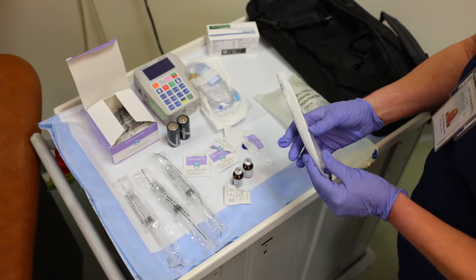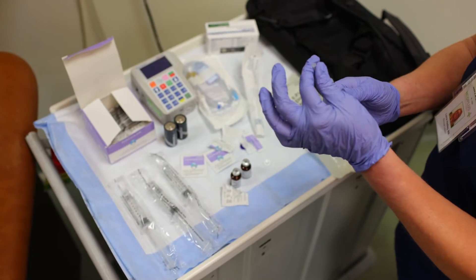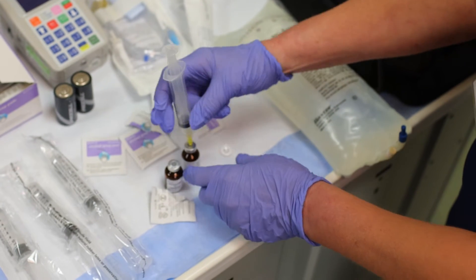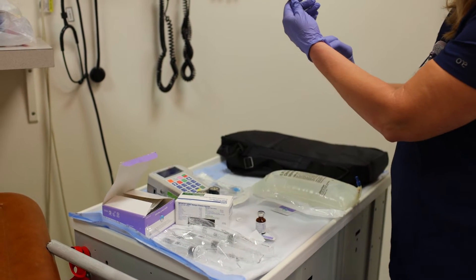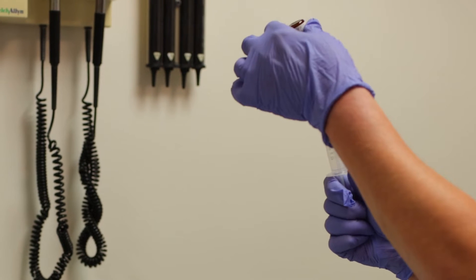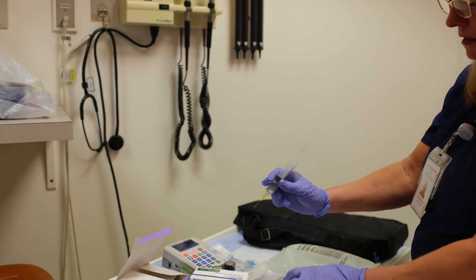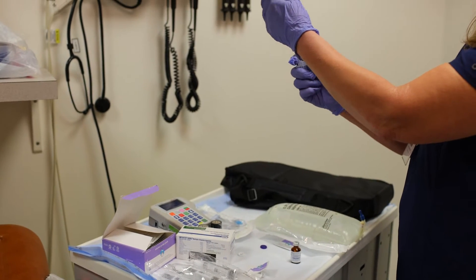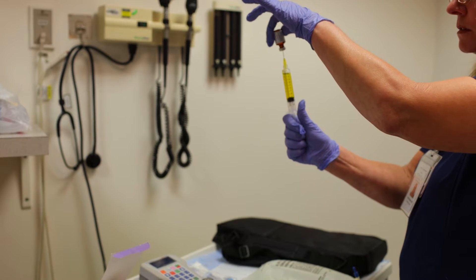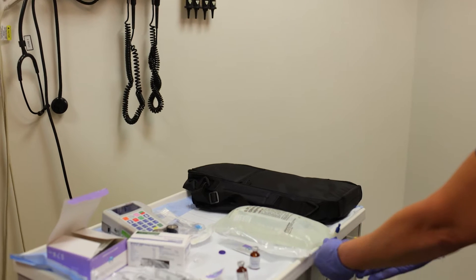You're going to use one 10 ml syringe for your vitamins. Make sure that's on tight, pull that off, put a little air in it. Turn it upside down and pull all the contents out of each vial. I'm going to get the contents out of this vial with the same syringe.